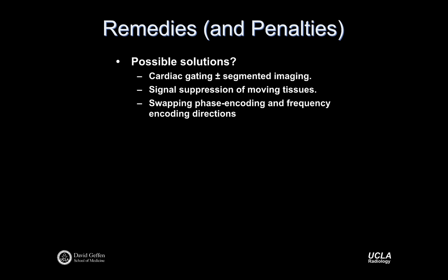I didn't put those slides in here, but we talked about having spins that flow into the slice. They're brand new and they're fresh spins. There are techniques to saturate the spins before they get into the slice. So we can play a saturation pulse, for example. We can play this 90 pulse, and when they get into the slice, they're saturated, or we can make it such that their transverse magnetization is very, very low. So there's different ways of dealing with the moving spins themselves as well.